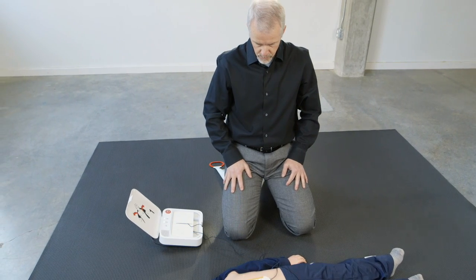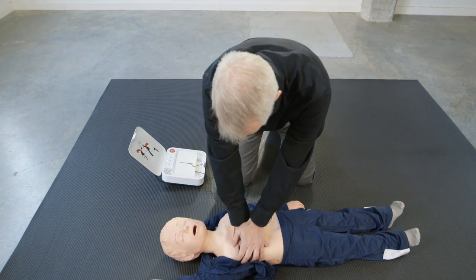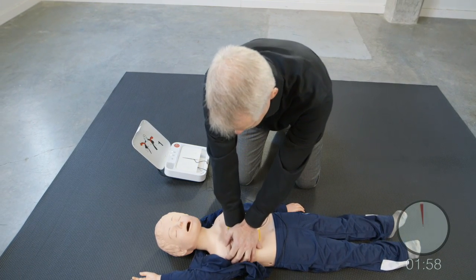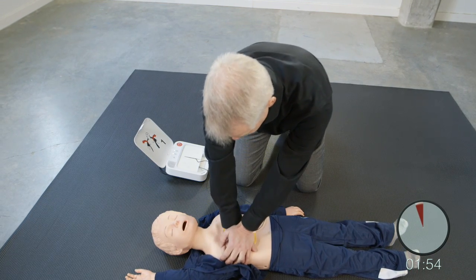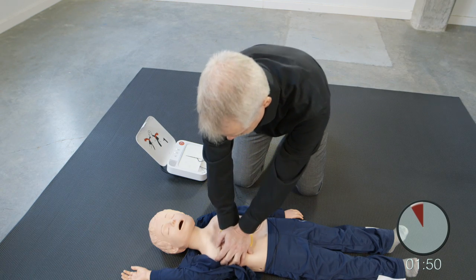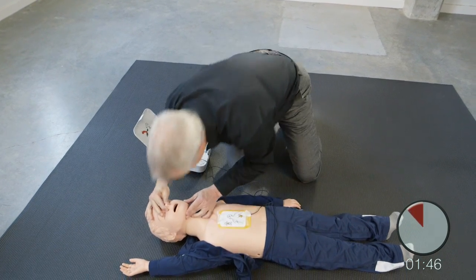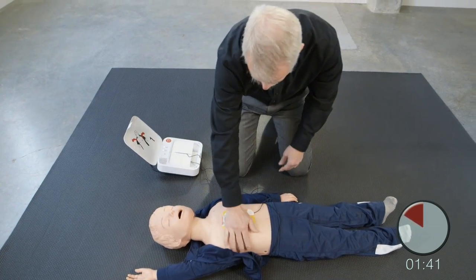Provide chest compressions to the beat. The heel of one hand should be in the center of chest. The other hand should be on top of the first hand. Push down deep. Provide two breaths: 1, 2. Resume chest compressions.